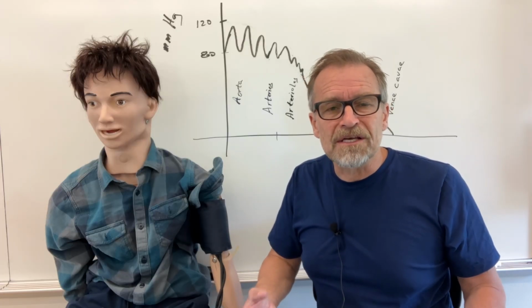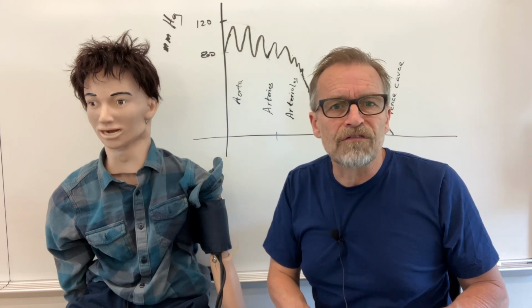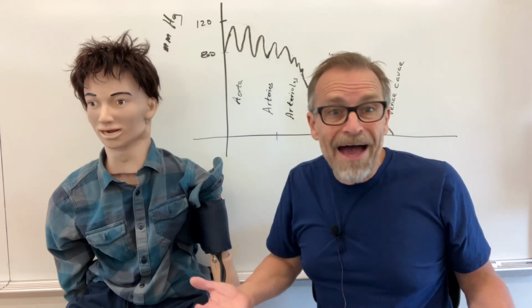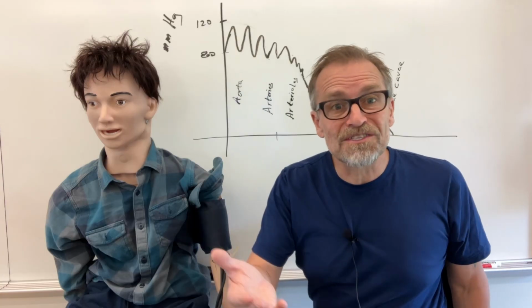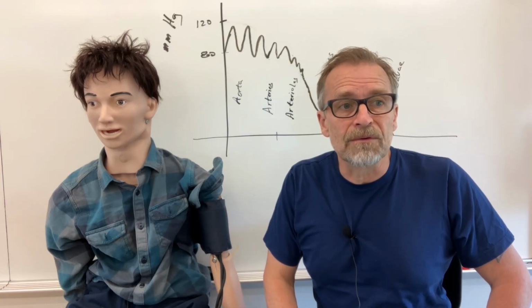And that makes sense because now there's no restriction. The blood can flow right through the cuff because the cuff is no longer slowing the arterial flow. And as a result of that, I don't hear the beating anymore. So that allows me to get a systolic and a diastolic pressure. That's all the blood pressure cuff is doing, right?